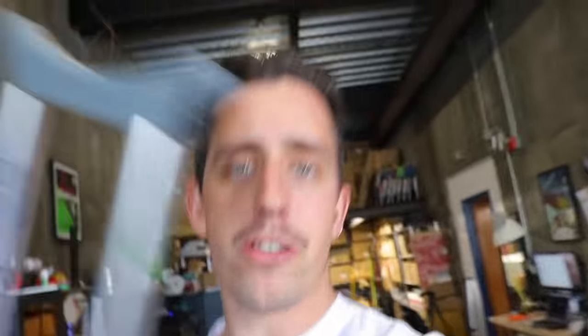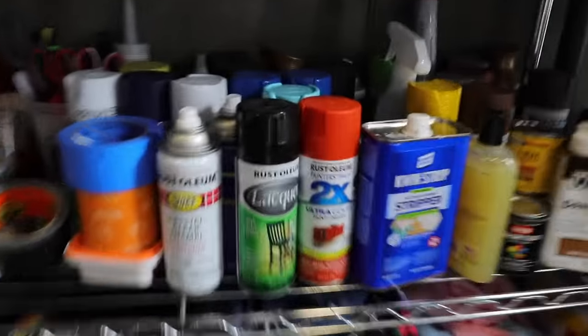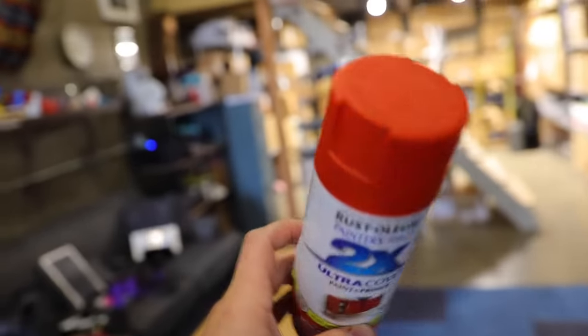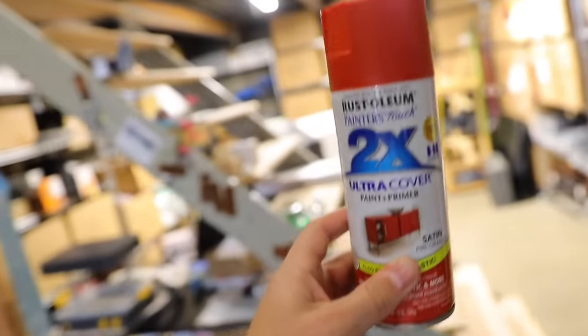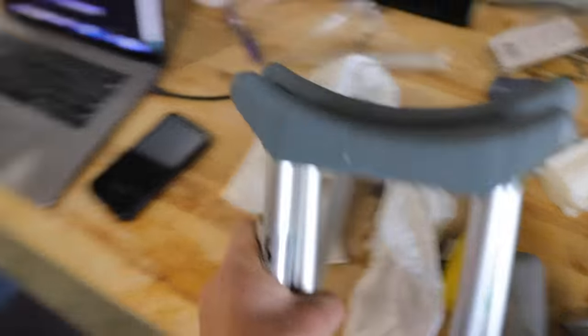While those parts are going on the 3D printer, if we're going to be making some extreme pogo stick crutches we need something more extreme looking than this classic crutch gray color. Let's find the perfect color. Yellow says a little too much caution — I would do blue but I don't think I have quite enough. I think this is the color right here, really going to get your attention when you're hopping down the street. One, two, three, four pieces to paint.